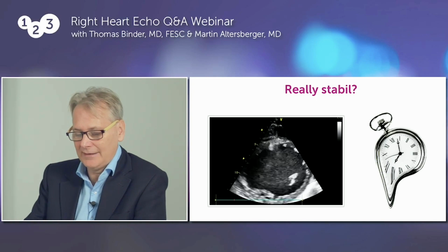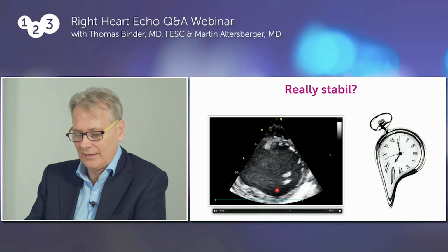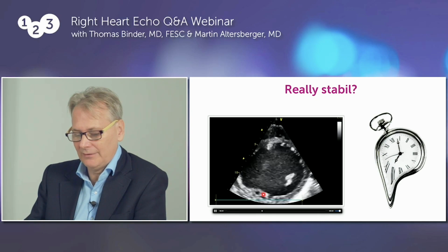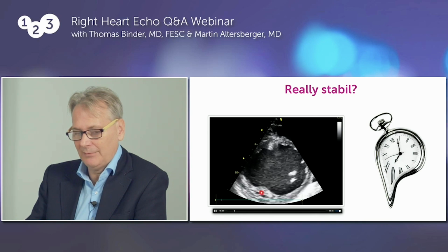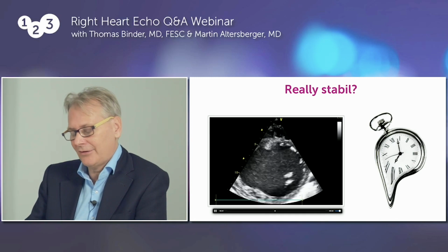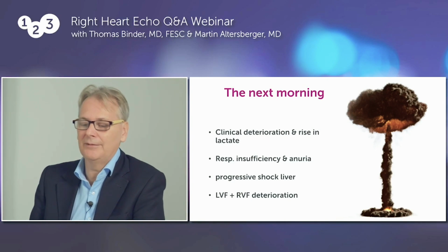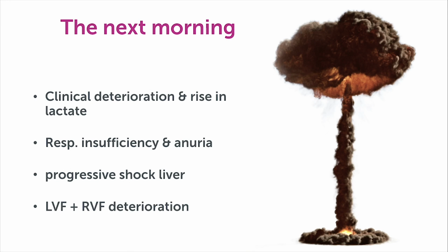And here is a short axis view that looks at his heart. What you can see here is hypertrabeculations. I would be wondering if this maybe is some form of non-compaction. Very poor left ventricle function. His heart rate is high, so he's really on the edge there. And then the next morning, boom, we're back to where we were.